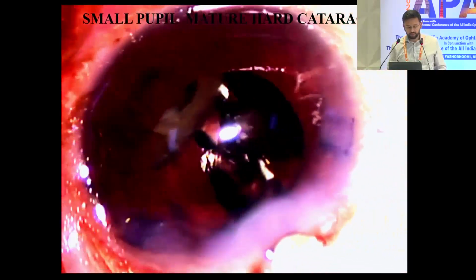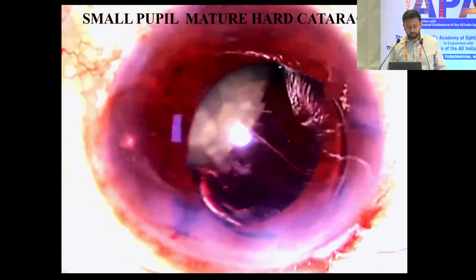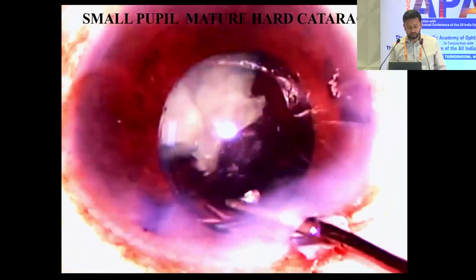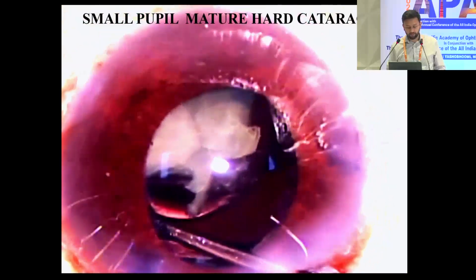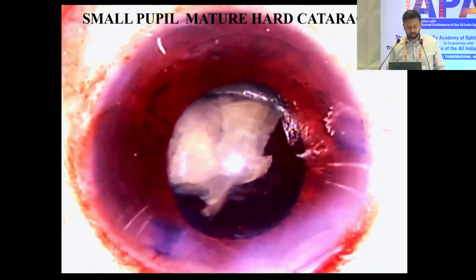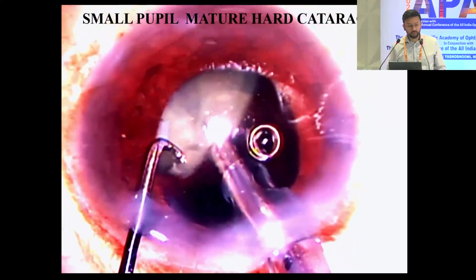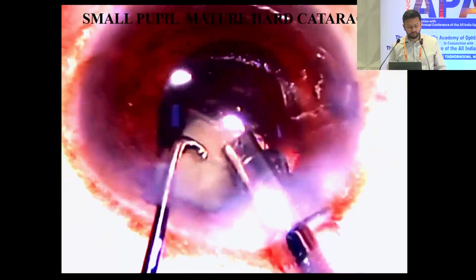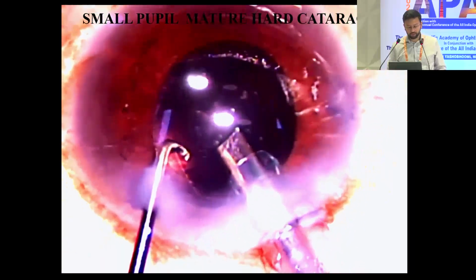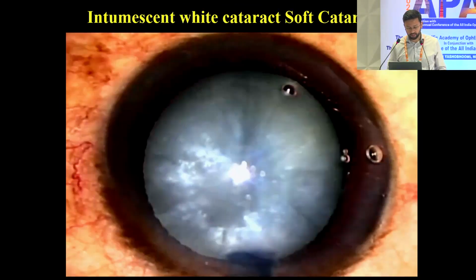So here again we are attempting scaffolding the tear with the IOL. We are placing the IOL here in the sulcus, under the fragment. We carefully place the leading haptic in the sulcus first. Now we can easily emulsify the remaining nuclear fragments without chances of loss in the vitreous. So these steps can be performed only when you're sure that there is no vitreous prolapse already happening, because if there is vitreous in the AC, then we cannot attempt these steps.